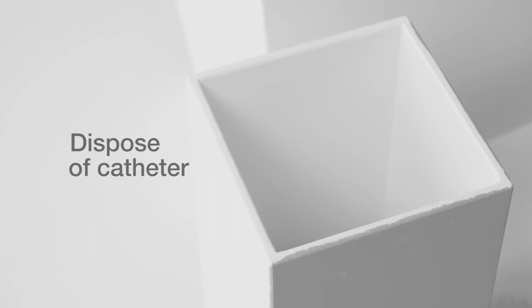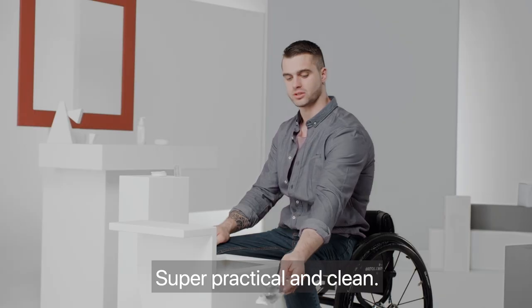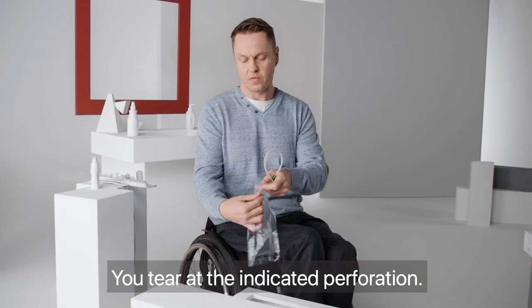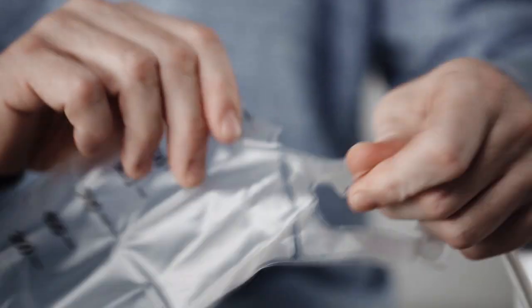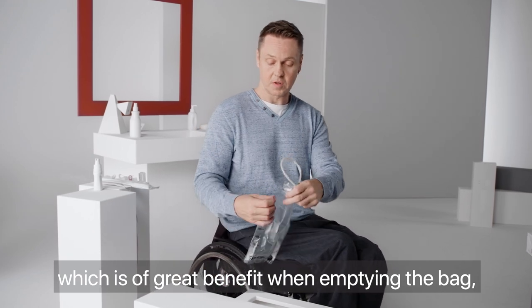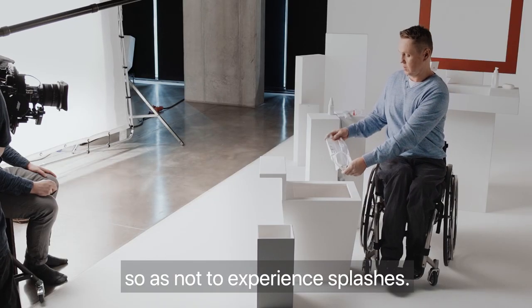Now simply dispose of the catheter and packaging in a disposal bin — please do not flush down the toilet. It's easy, it takes two seconds. It's super practical — you put it in the towel wrap, cut it off using the perforation provided. This gives a straight cut, which is a very good advantage for clean disposal, and you don't spray the area anymore.